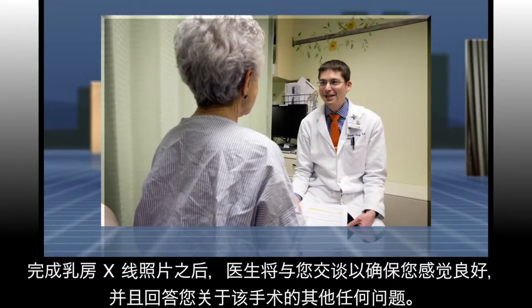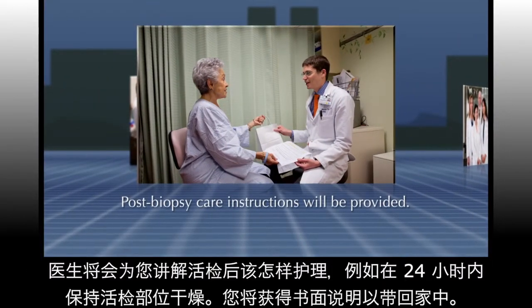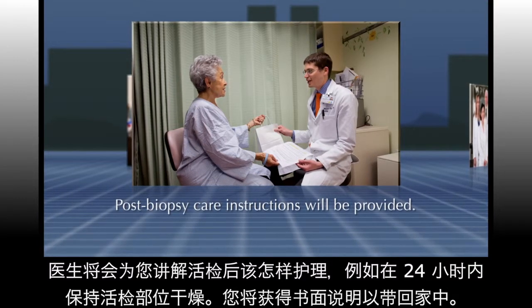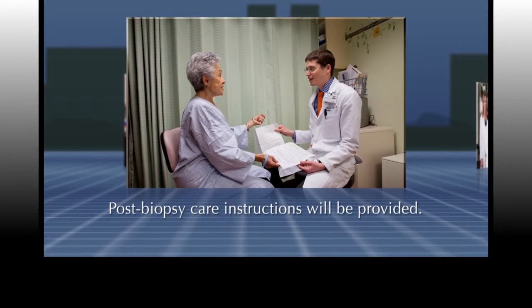After your mammogram, your doctor will speak with you to make sure you are feeling well and to answer any additional questions you may have about the procedure. Post-biopsy care instructions will be explained, such as keeping the biopsy site dry for 24 hours, and you will be given the instructions in writing to take home with you.